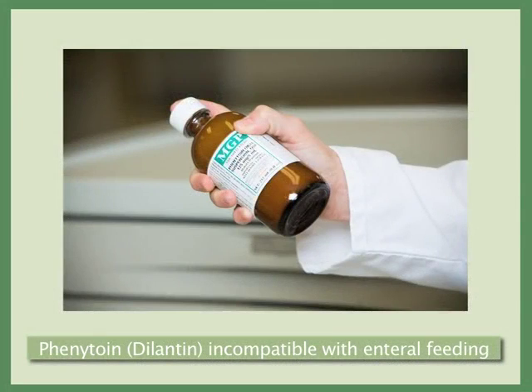Phenytoin or Dilantin suspension is an example of a medication that is incompatible with enteral feedings. The absorption of phenytoin is greatly reduced when the two are administered together. If it is impossible to administer incompatible medications at a time when the feeding is not running, monitor for adverse effects, such as seizure activity, and document such monitoring in the resident's record.